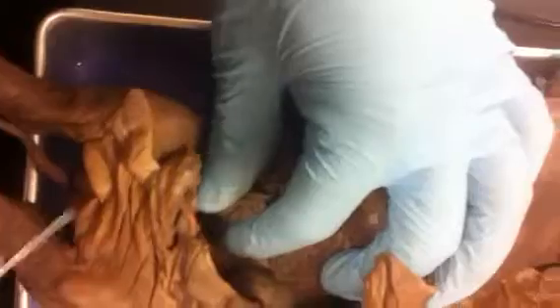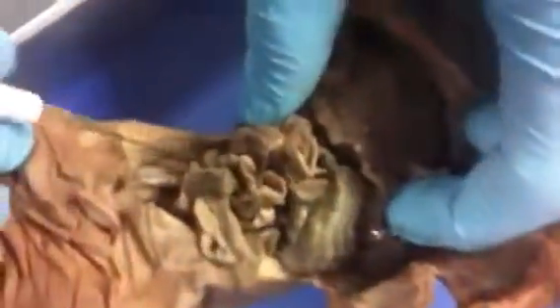The kidneys are right here. The umbilical vessels are right here. And then the urinary bladder — if you follow the kidneys, they'll lead you right back here to where the urinary bladder is.